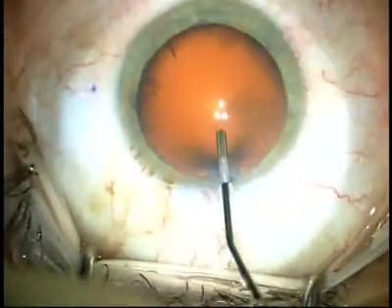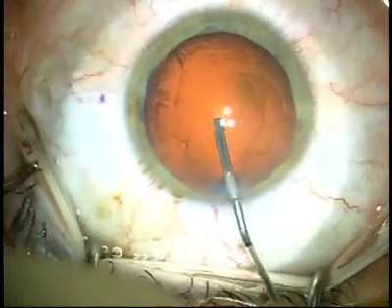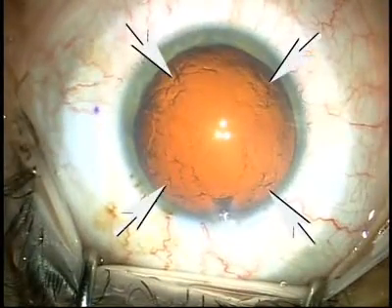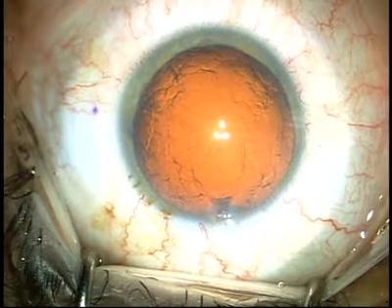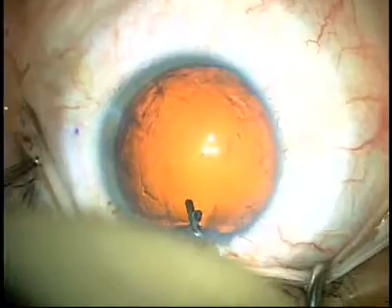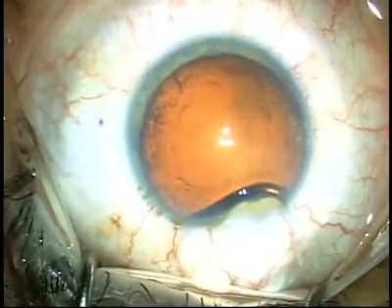What you're seeing on the screen is Helon 5 going into the eye. It tends to compress centrally and be quite smooth, but has some irregularities peripherally, as noted by the arrow. When we inject the Helon into the anterior chamber to create a soft shell technique, the irregularity is peripherally smoothed out and we create a relatively smooth undersurface with the viscoelastic.